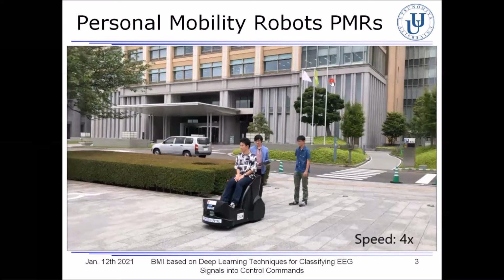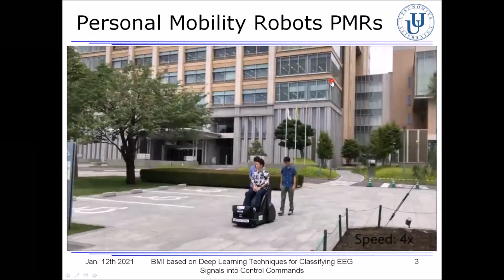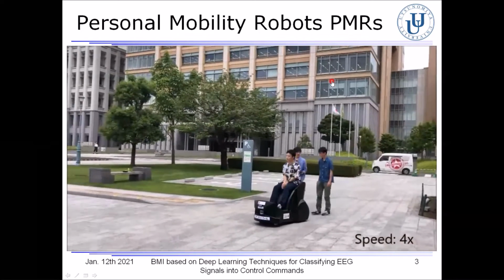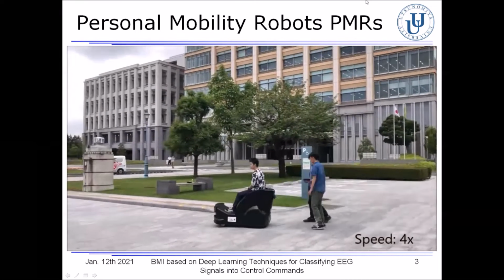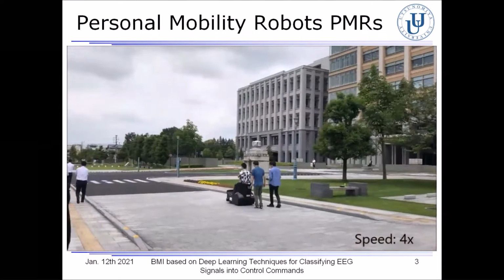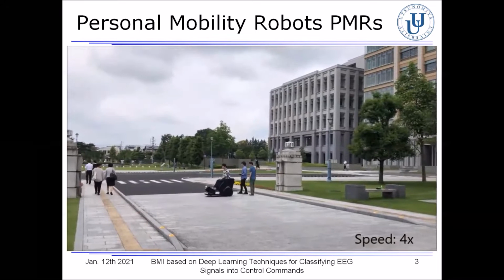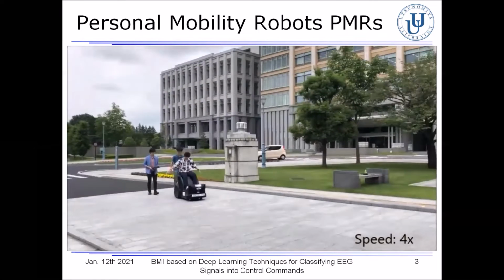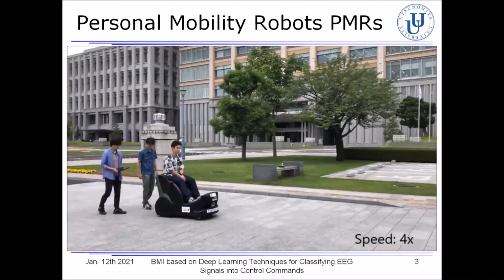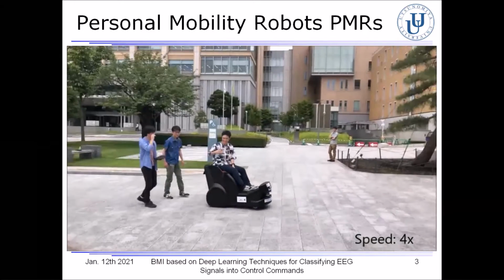As you can see here in this movie, the personal mobility robot PMR is autonomously moving toward a destination through some given waypoints. On the other hand, the user can manually control the PMR through the joystick. However, it is difficult for users with their hands full to grasp the joystick. In this case, we believe that mental commands are more useful to control the PMR.